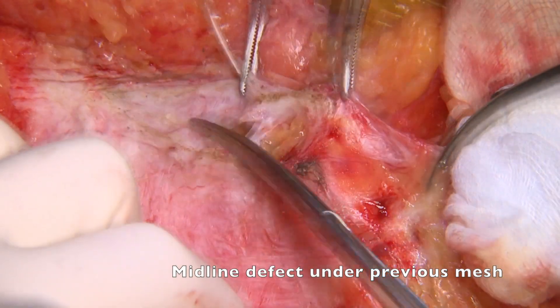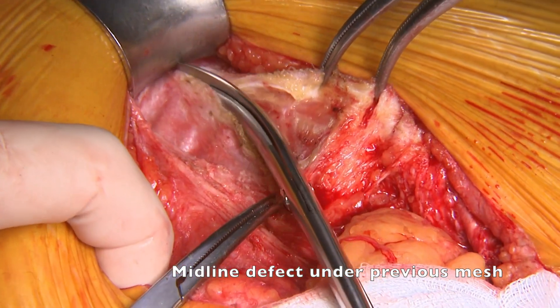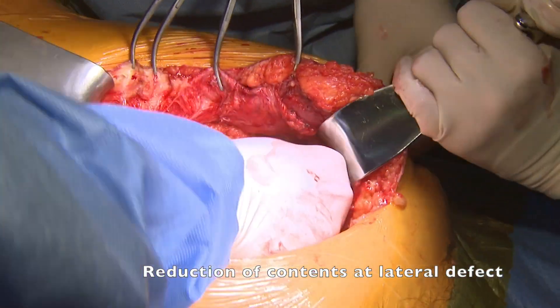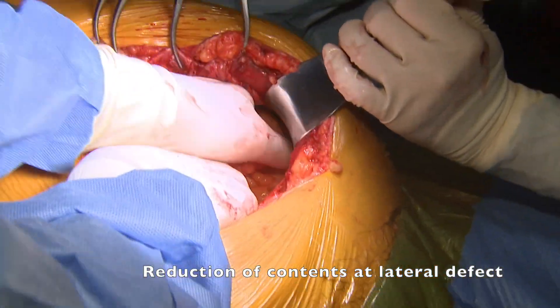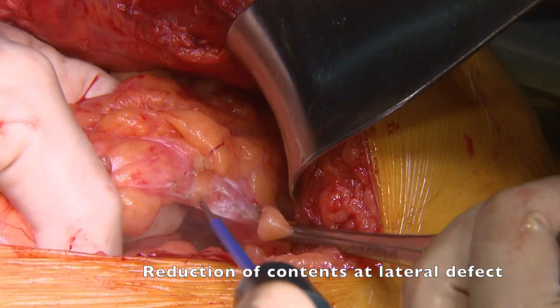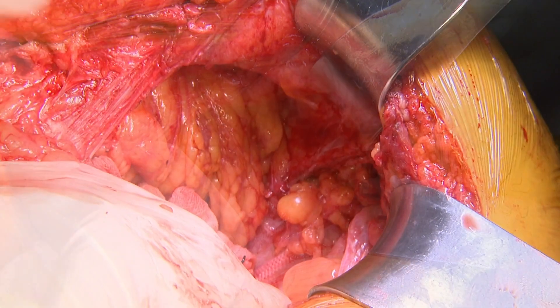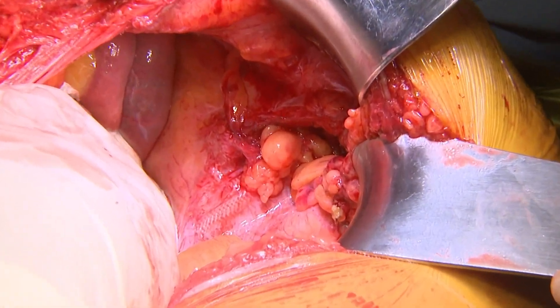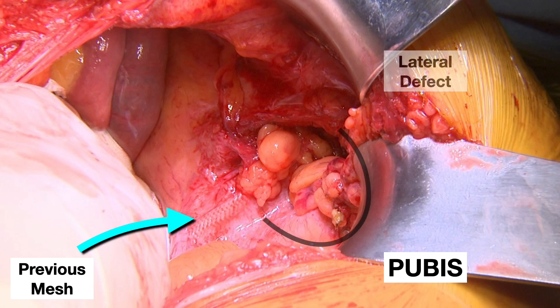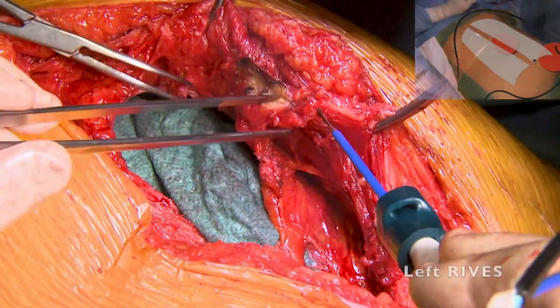We identified the midline sac that contains the previous onlay mesh, well integrated without showing tough adhesions to bowel. We then performed the reduction of contents on the lateral sac. At this level, we checked the lateral defects superior and lateral to the previous intraperitoneal mesh. After completing the adhesiolysis, we proceeded to protect our visceral contents with a towel.